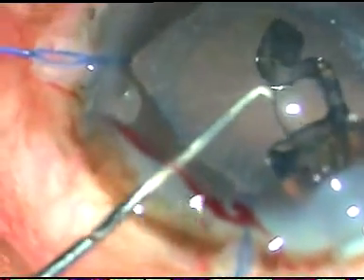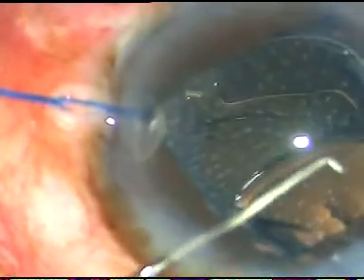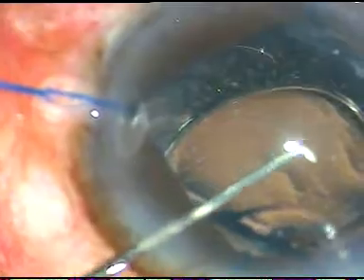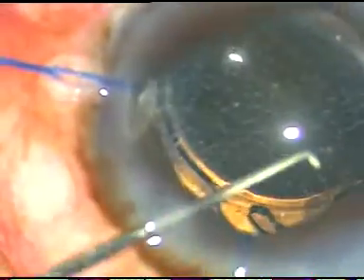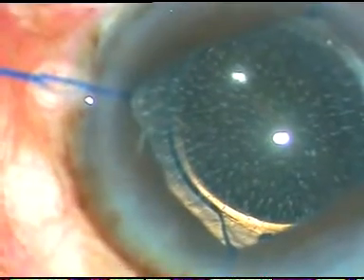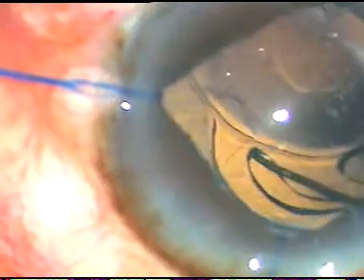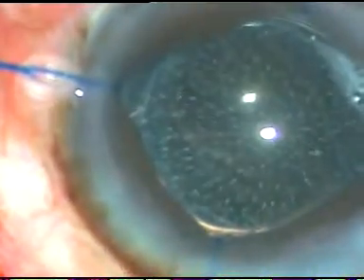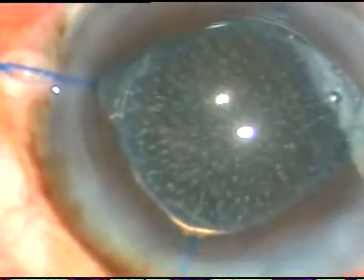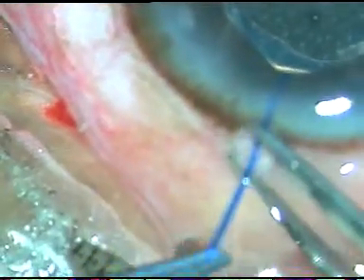The lens leading haptic is guided into the capsular bag and the trailing haptic is pushed into the anterior chamber and also guided into the capsular bag by dialing. Now I am removing the hooks — see how easy it is. Just pull them out. So the four iris hooks are removed.